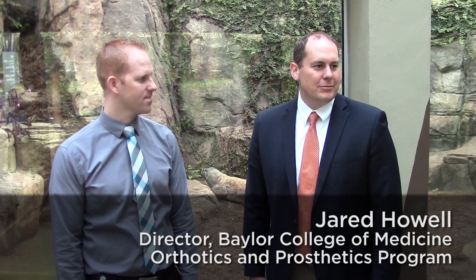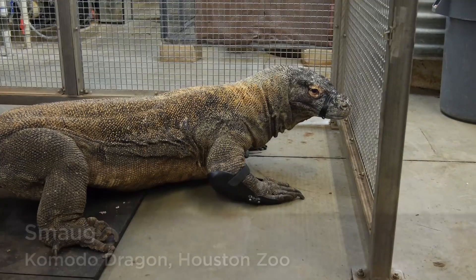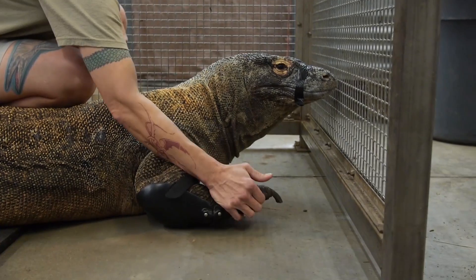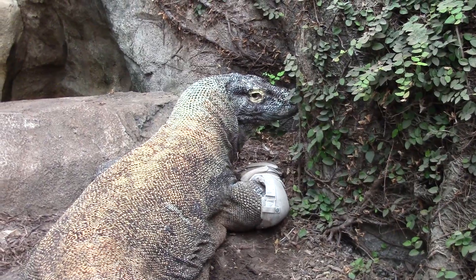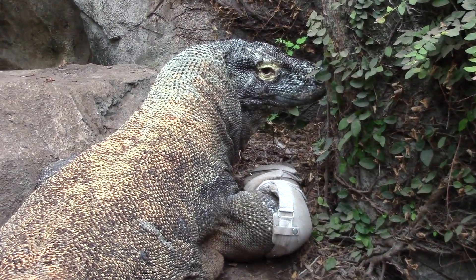I have to admit I was a bit surprised. I got the call from Dr. Lauren one day and she said, 'I've got a proposition for you. Why don't you come over and take a look at our Komodo dragon?' I certainly have never worked with a Komodo dragon before. Basically what's happened is he's not able to pick up his foot — not atypical from what we see in able-bodied humans. We call that a foot drop in layman's terms, or some kind of nerve paralysis.